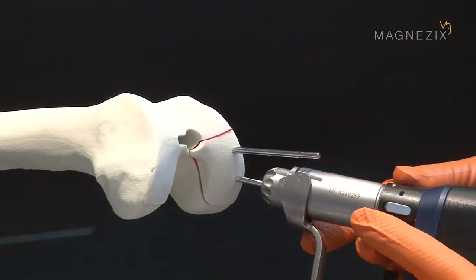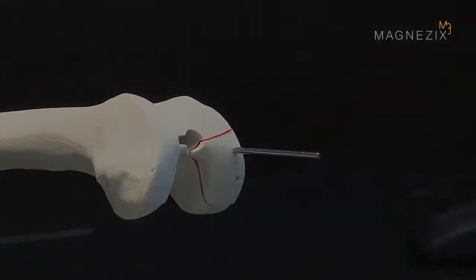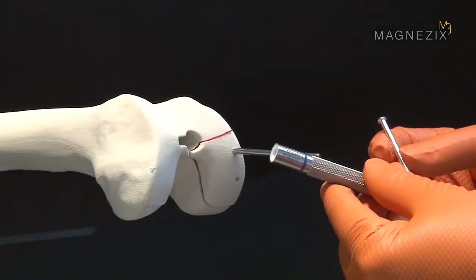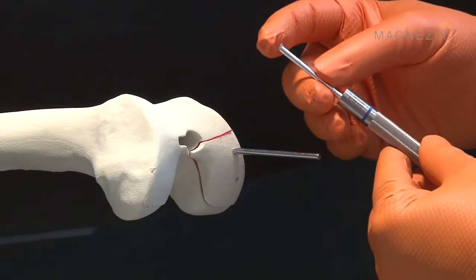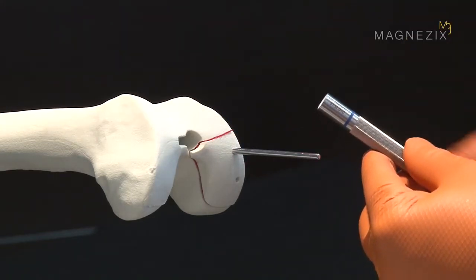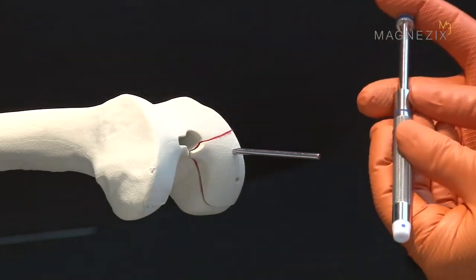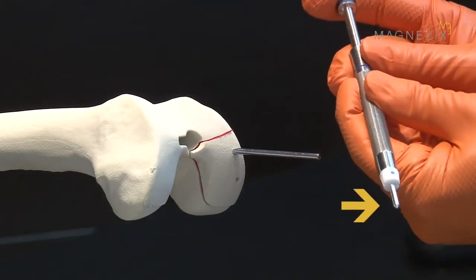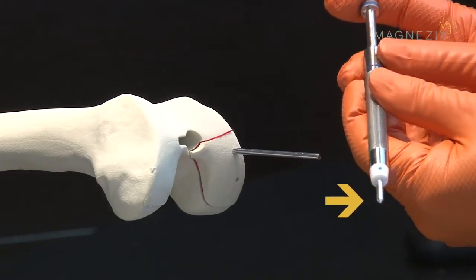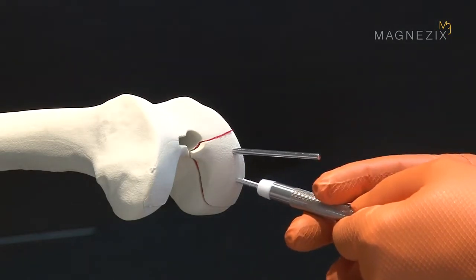The first reduction wire is now removed. The first 50 mm pin is inserted into the impactor sleeve. The impactor insert is reinserted and pushed forward until the pin appears at the impactor tip. The tip of the Magnesix pin can now be positioned in the pilot hole.